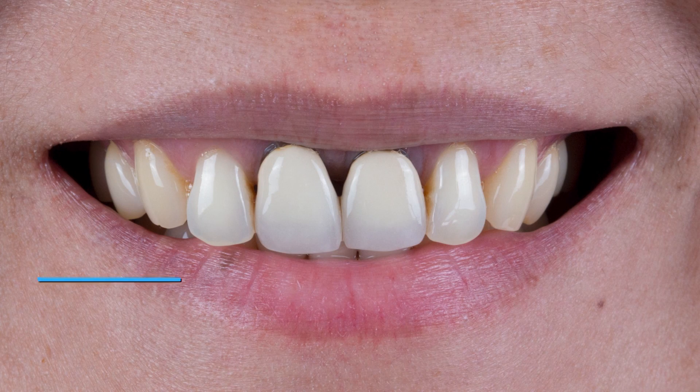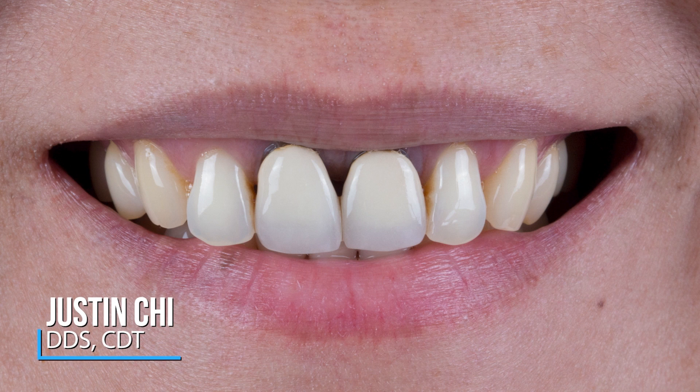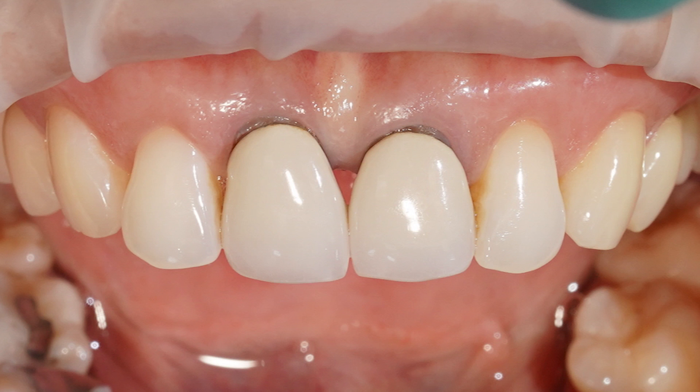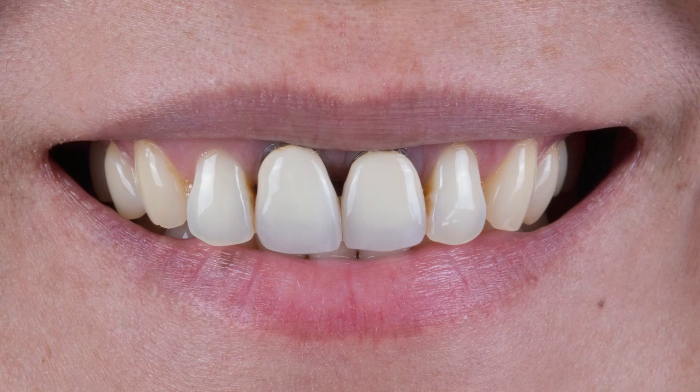For this case, the patient presents with existing PFM restorations on tooth numbers 8 and 9. You can see the classic PFM appearance, especially in the anterior where the restorations and soft tissue have quite a bit of a gray appearance. Having been endodontically treated, the exposed dark tooth structure also lends to the poor aesthetics of these teeth. The contours could also be improved, so we do want to enhance this patient's aesthetic situation with some new restorations.